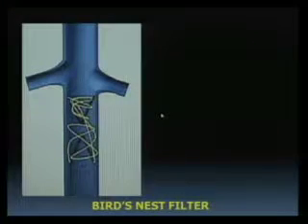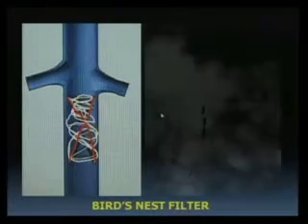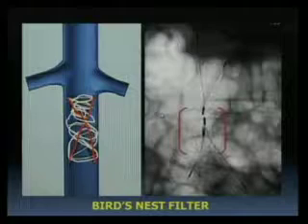But the problem with this one is the process is 7 steps. And in fact, we don't place them very commonly, so every time we place them, we review the steps. So there is a nest, and the nest is held by 2 anchors. We have a proximal anchor, a distal anchor, and then the nest of wire.